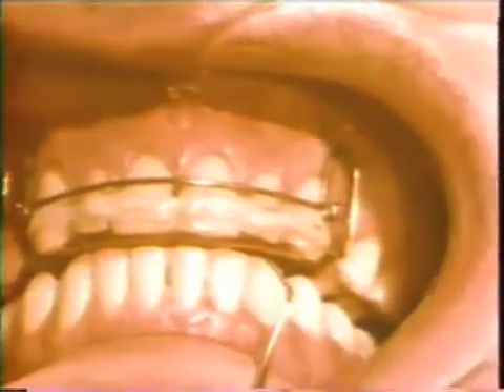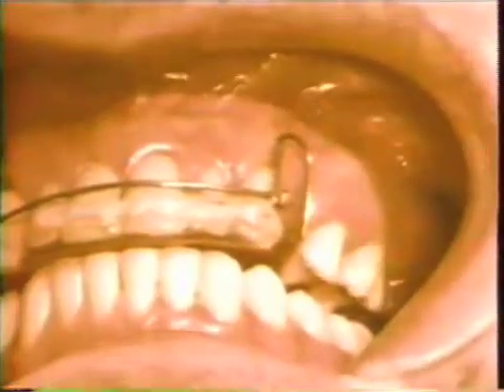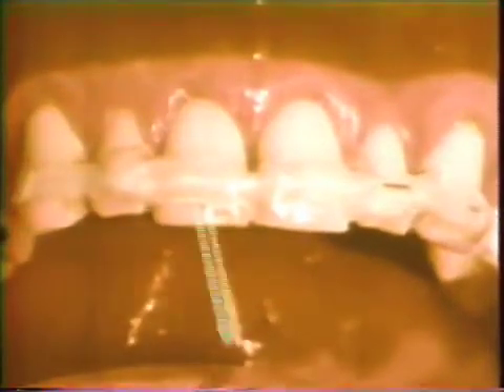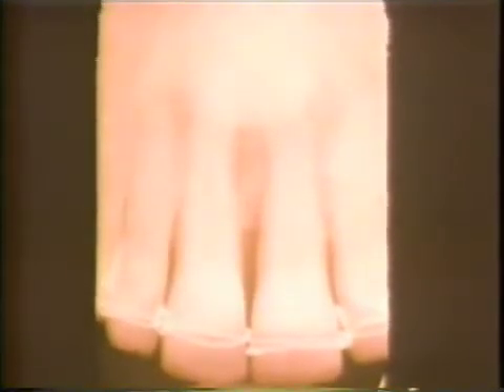After the diastema was closed, the teeth were immobilized with a stainless steel wire and acrylic extracoronal temporary splint. This splint remains in place during the entire operative procedure and during the healing process following the autogenous bone graft. This film shows the area after tooth movement has been accomplished, and the teeth have been stabilized with the wire ligature splint.